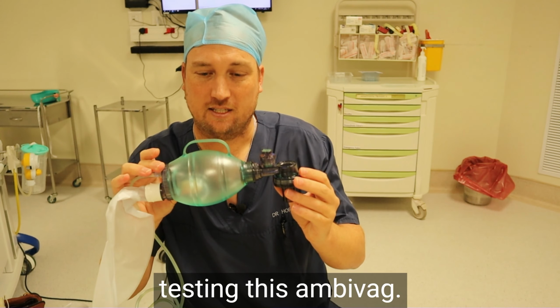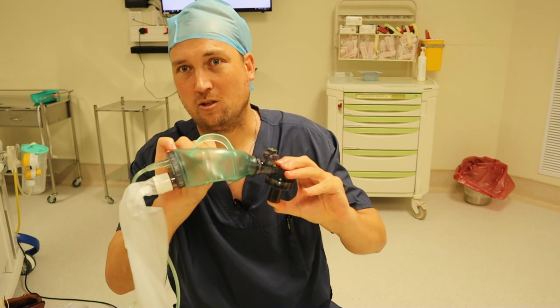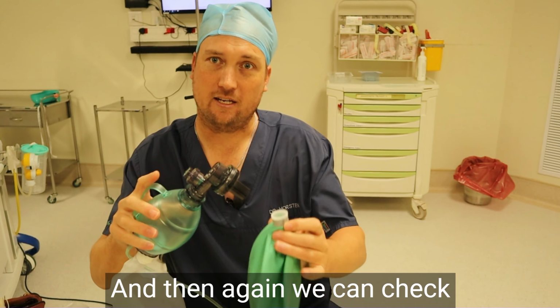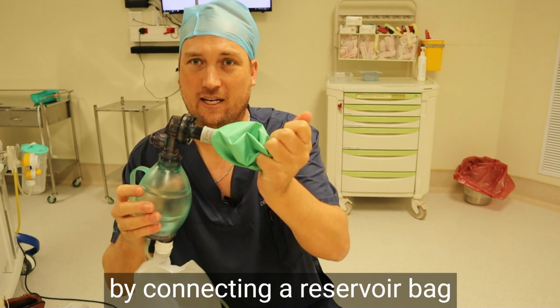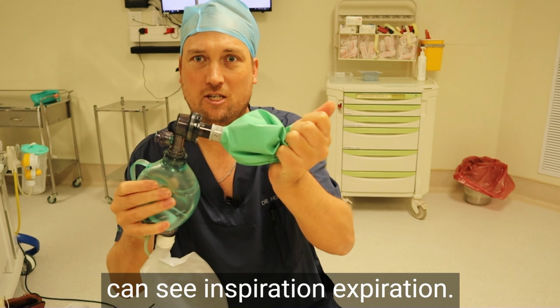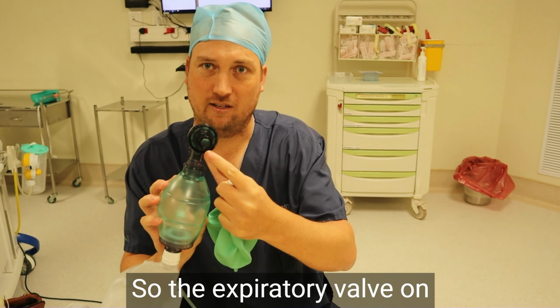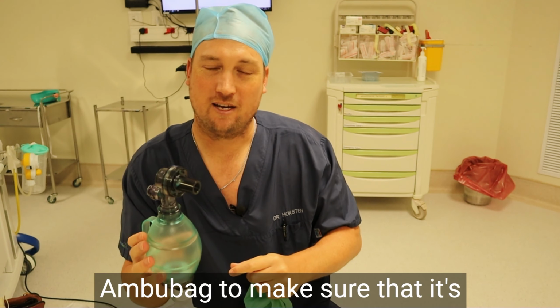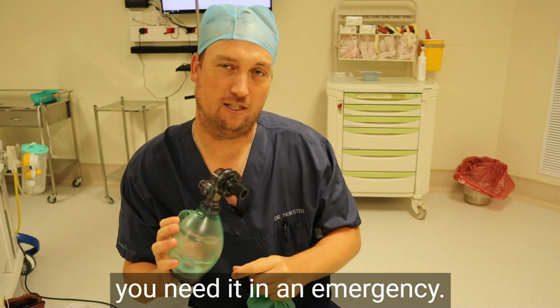The same applies in testing this ambu bag. We now know that we can generate a positive pressure. We know that the bag will re-expand and reinflate from the back. And then again, we can check that the patient is able to exhale by connecting a reservoir bag, filling it up with air, and we can see inspiration, expiration, inspiration, expiration. So the expiratory valve on the ambu bag is working. And that's how you check an ambu bag to make sure that it's going to be there, ready to use when you need it in an emergency.